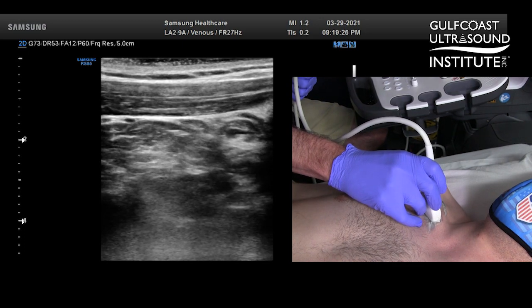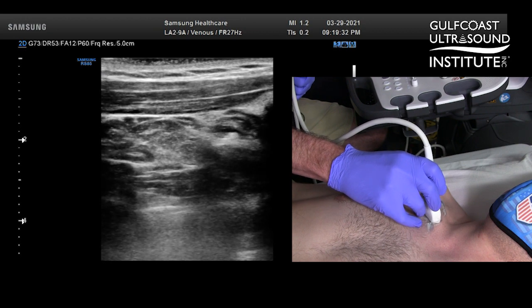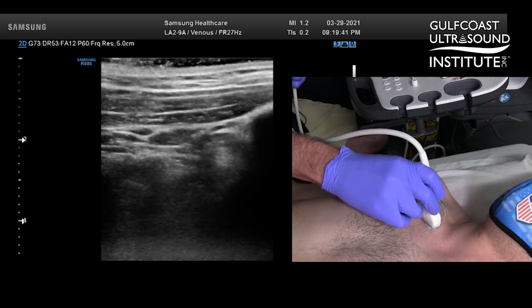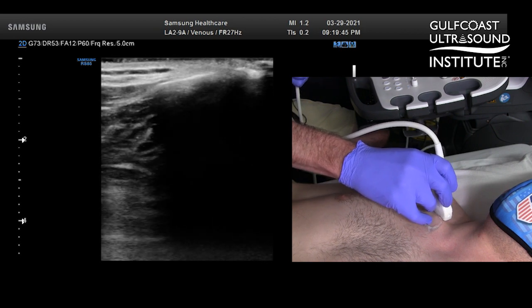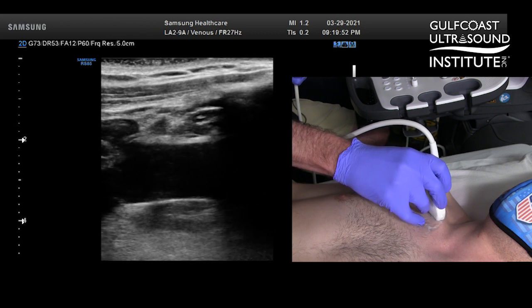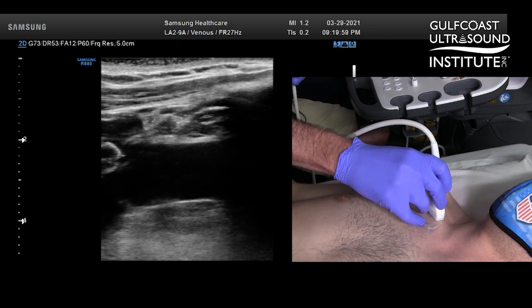Whether you're performing an ultrasound guided vascular access procedure or an upper extremity venous ultrasound, this area can be quite challenging. Typically what's going to happen is the sonographer or the medical provider is going to take the transducer, go below the clavicle, and lay it transverse on the patient's upper chest. The problem with that is you're actually going to be oblique on that axillary vein.